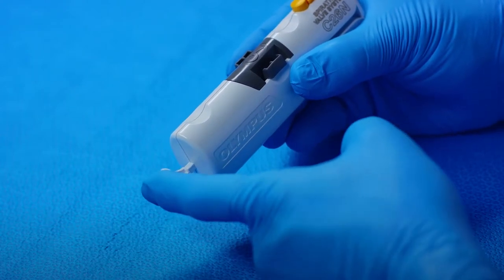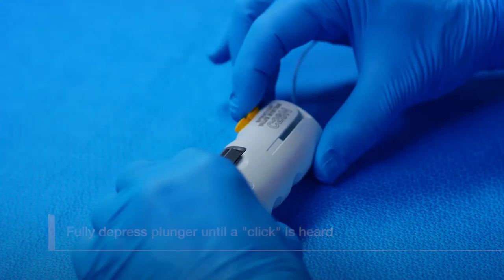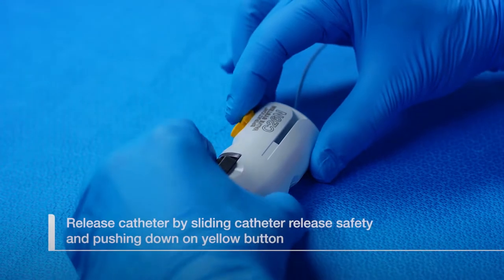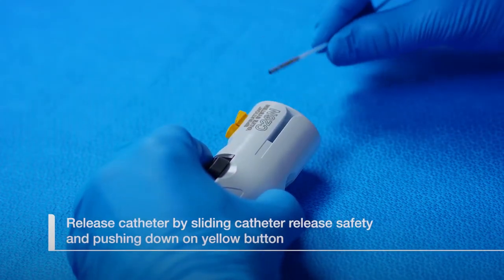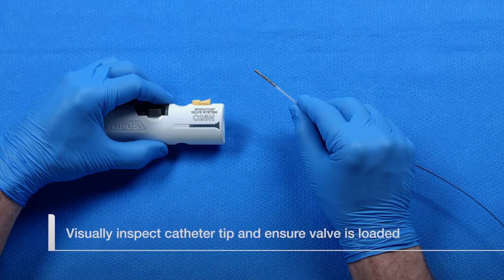To load the valve into the catheter, fully push the loader plunger until an audible click is heard. Release the catheter by pushing and holding the catheter release safety slider forward, then pressing the catheter release button down until an audible click is heard. Once the catheter is removed from the loader, visually inspect the catheter tip to ensure that the valve is loaded correctly.